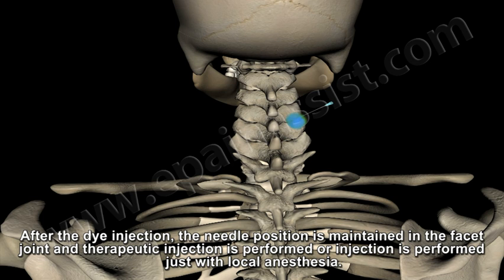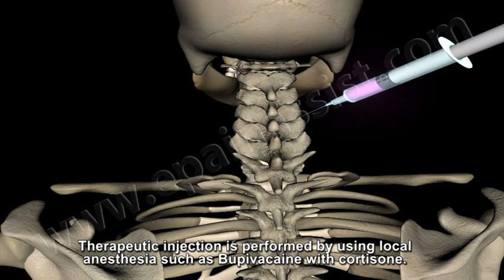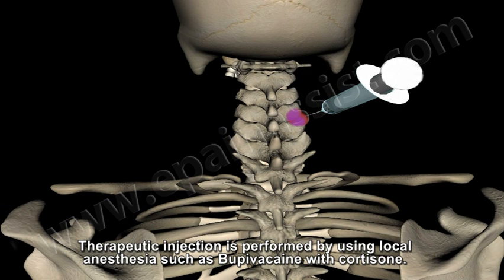After the dye injection, the needle position is maintained in the facet joint and therapeutic injection is performed, or injection is performed just with local anesthesia. Diagnostic injection is performed with only local anesthesia such as bupivacaine, which is a long-acting anesthetic. Therapeutic injection is performed using local anesthesia such as bupivacaine with cortisone.